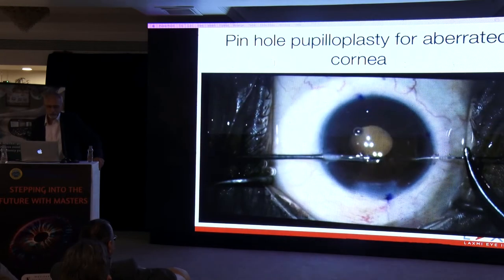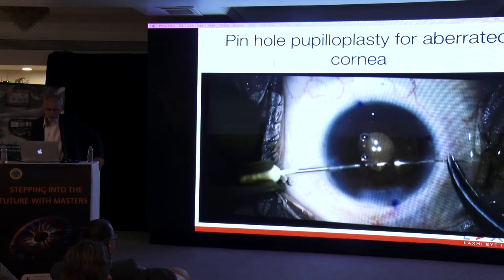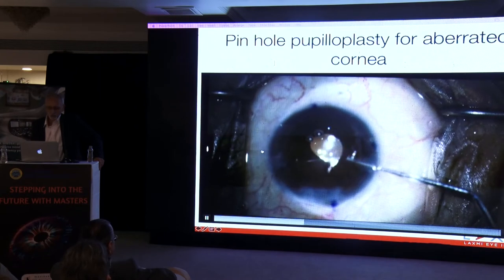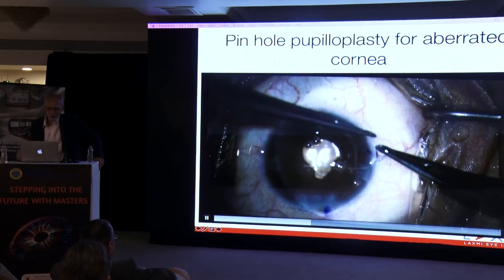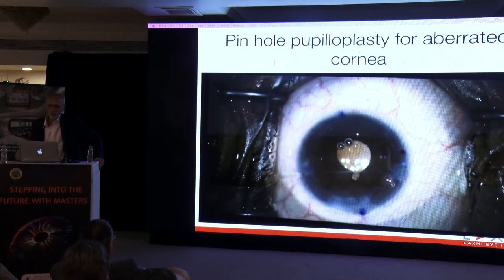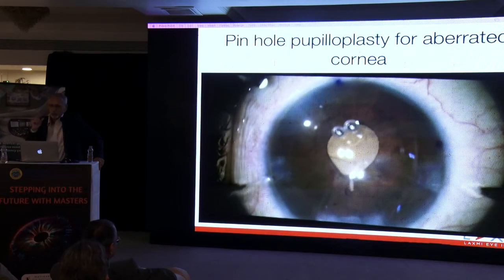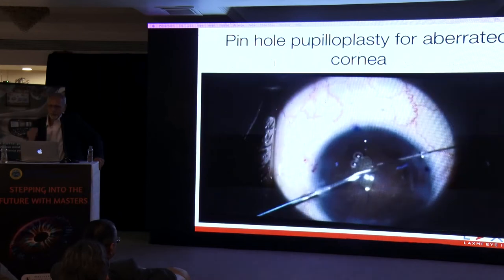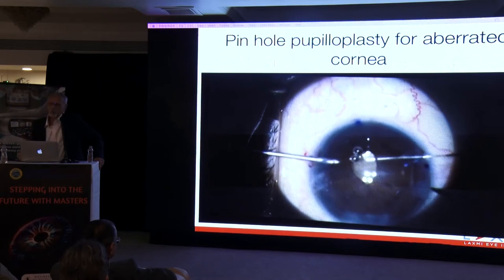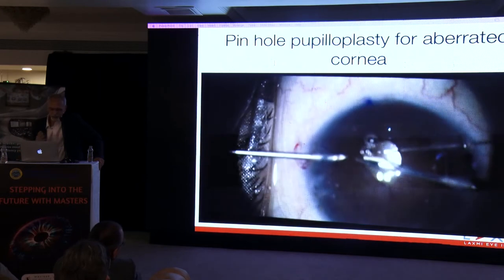So a thing that we normally use today is pinhole pupilloplasty for these patients. Earlier, the concern used to be, what if I close this pupil? How will I do that fundus examination? But that's not an issue today with the better fundus cameras that we have. You can always do it through a very tiny opening, the entire retina can be seen. And for some reason, if you want to open it up, it's only a setting on a YAG laser, and just YAG it, and it just comes off.